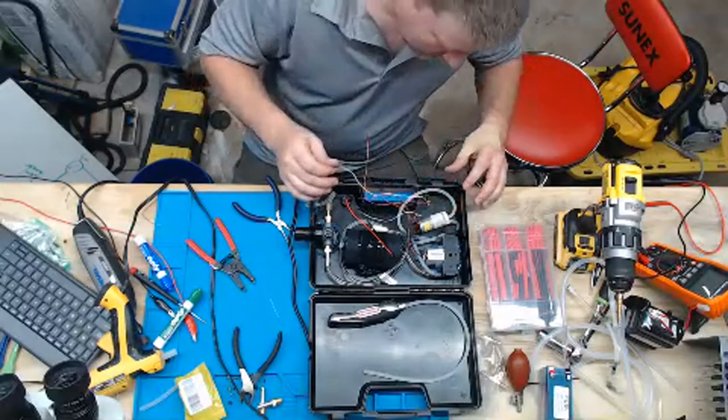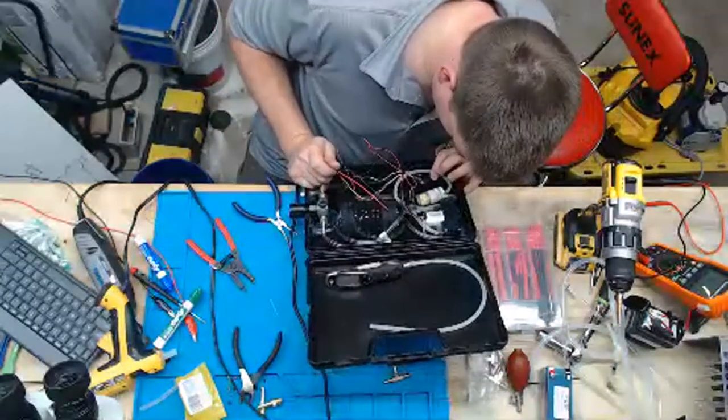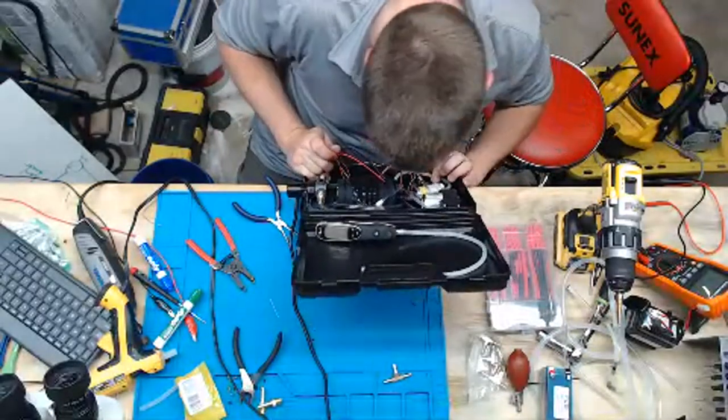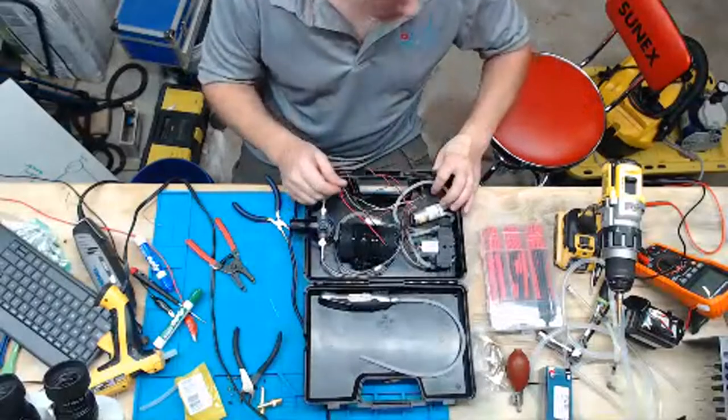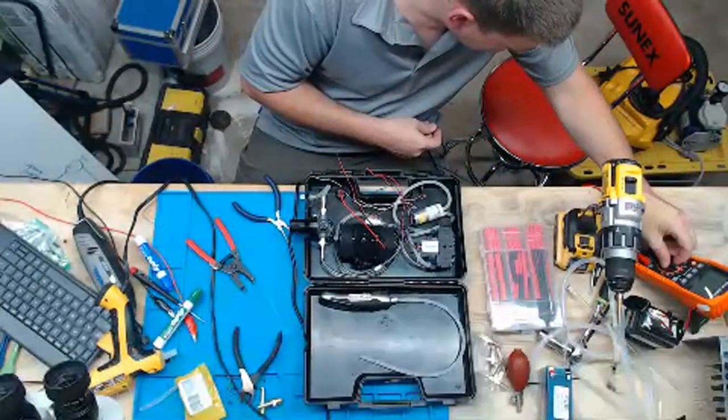Let's see if I remember right. Okay, so the important part is to note which connector is going to the positive pin on the DC input.